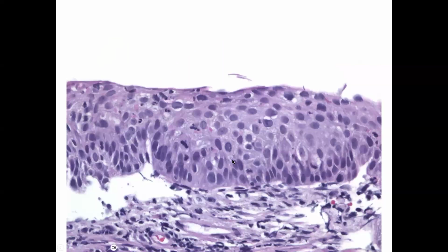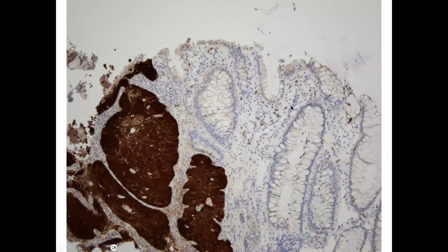When we look at this on higher power, there are some other abnormal features, like mitotic figures going all the way toward the surface here. Normally the proliferative area is just in the basal layer at the very bottom. So seeing mitotic figures all the way up at the surface is a very dysplastic feature. This is an example of anal dysplasia.